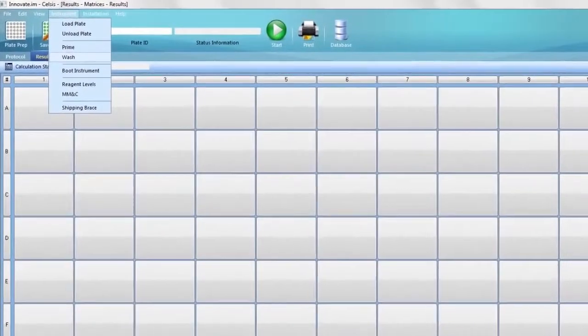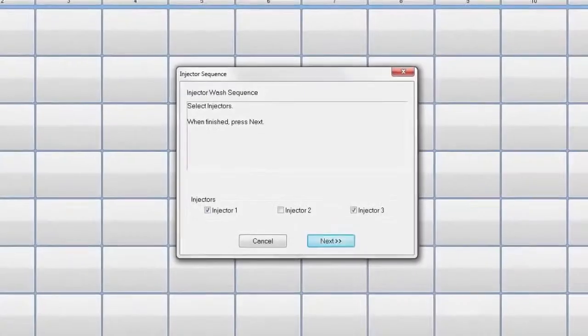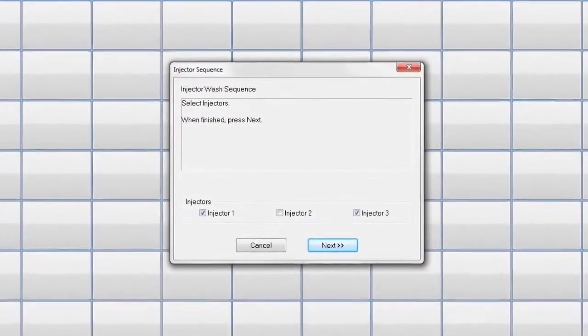Click Instrument Wash on the menu bar and follow the on-screen instructions. This daily wash cycle ensures the injector lines are clear.